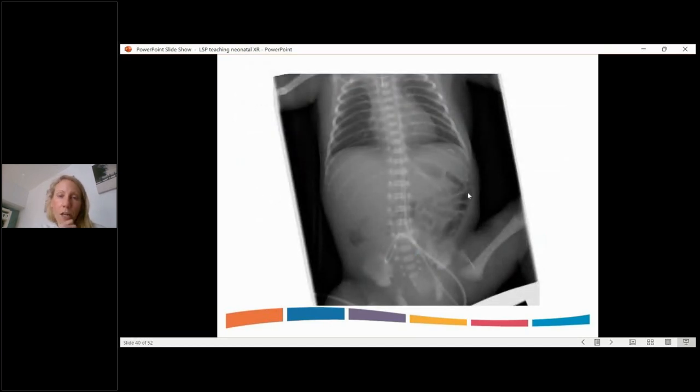And sometimes in hindsight, you might do grand rounds, or you might be looking back at a case of a baby that's having repeated feed intolerance. And it's often the standard preterm baby where we're really struggling to start feeds. But just look at these x-rays, and are there any areas of calcification? And are we struggling to start feeds because it's preterm and slower transition? Is there an ileus? Is there a stricture or previous NEC? Or is it that they've had that antenatal perforation? And you will see if you go back closely in a lot of these cases that there may have been an antenatal perforation.